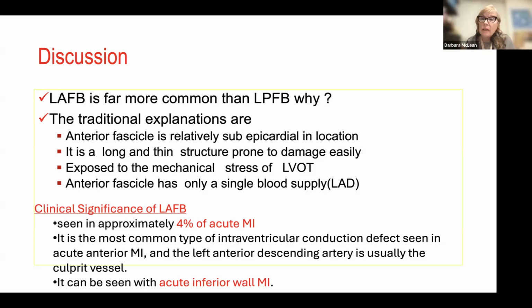So it isn't worthless to actually be able to look at an EKG and diagnose these things and be able to talk about them. And to know also that you might think it's an LAFB, and his was just a standalone LAFB, didn't even have a right bundle. But just a standalone LAFB, you might think it, and you talk to your cardiologist and they say, well, no, and here's why. Okay, great. What a great teachable moment.